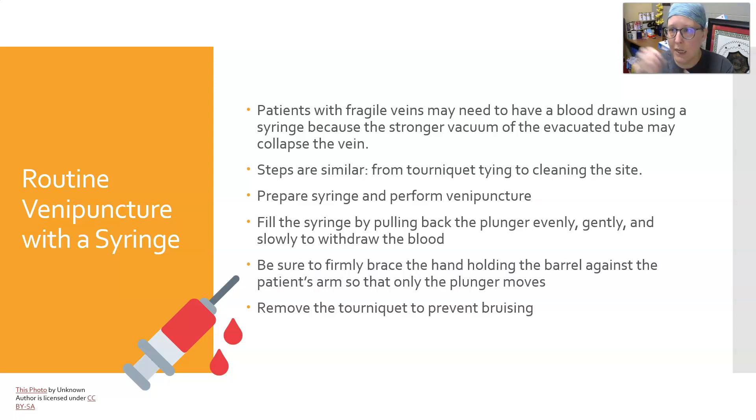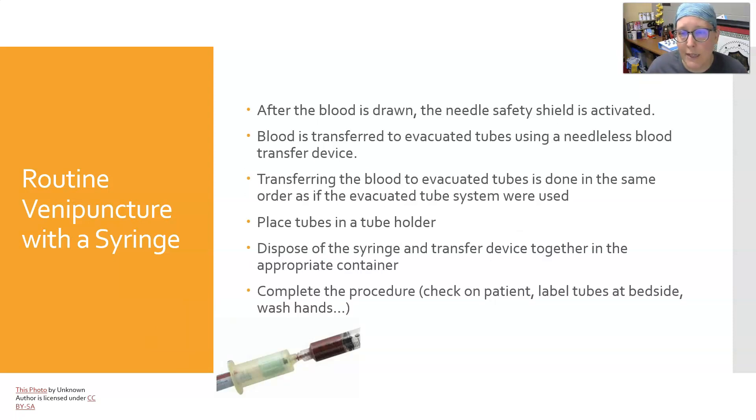Fill the syringe by pulling on the plunger evenly and gently to withdraw the blood — a slow, steady pull. If you pull too hard you could collapse the vein by creating a stronger vacuum and could hemolyze the blood. Make sure you firmly brace the hand holding the barrel against the patient's arm so that only the plunger moves and you're not pulling the needle out. Remove the tourniquet to prevent bruising, since if the patient's veins are more fragile they'll be more prone to bruising. After the blood is drawn, activate the needle safety shield — do not use the same needle to transfer blood into the tube.